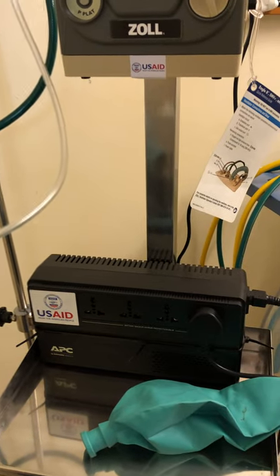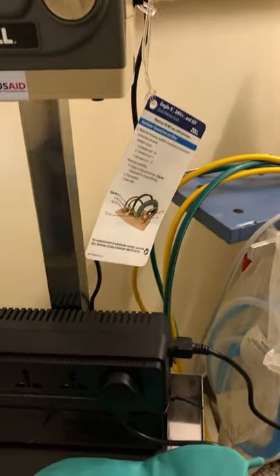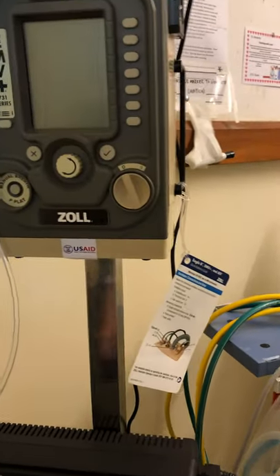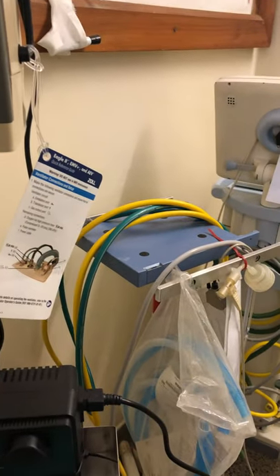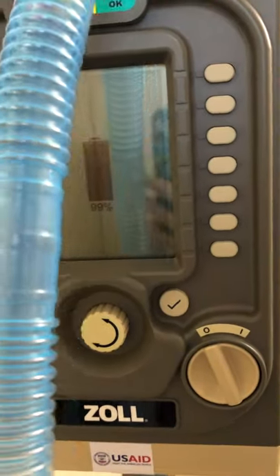This little two-minute directions does not replace clinical care and clinical judgment. The machine has a UPS on the cart, so the machine is plugged into the UPS and the UPS is then plugged into the wall. Make sure the UPS is on — you hit this button here. When the machine is plugged into power, it will just show that it's charging. The machine's not on now, it's just showing it's charging.